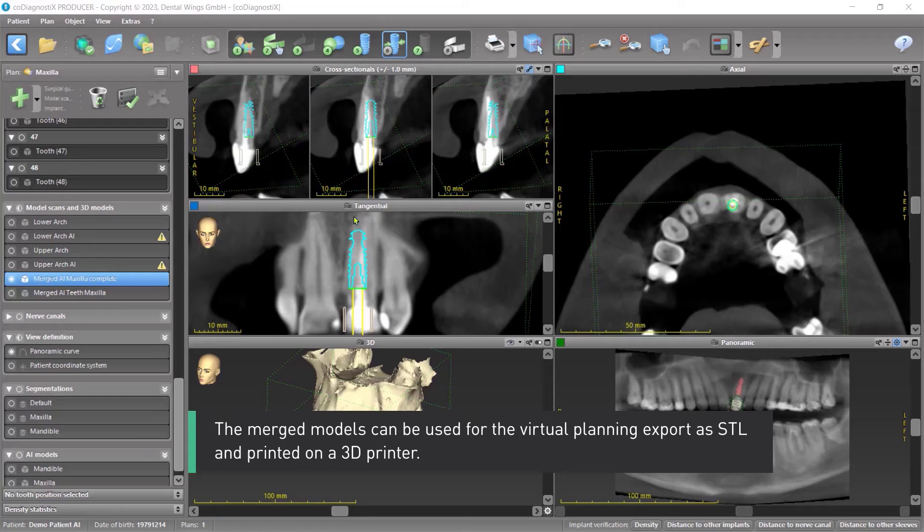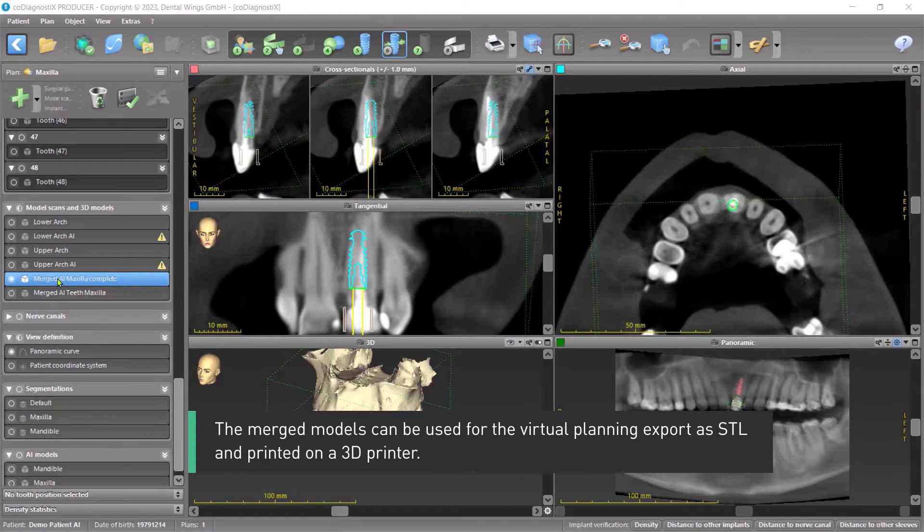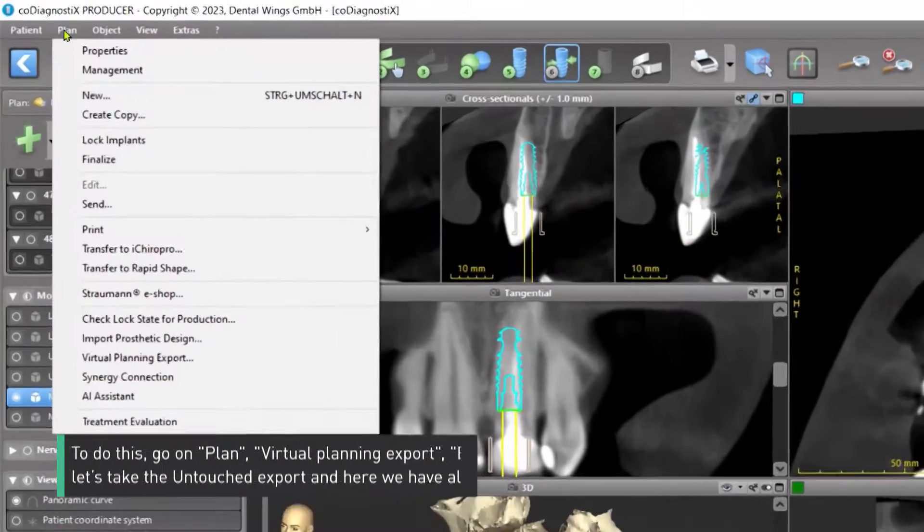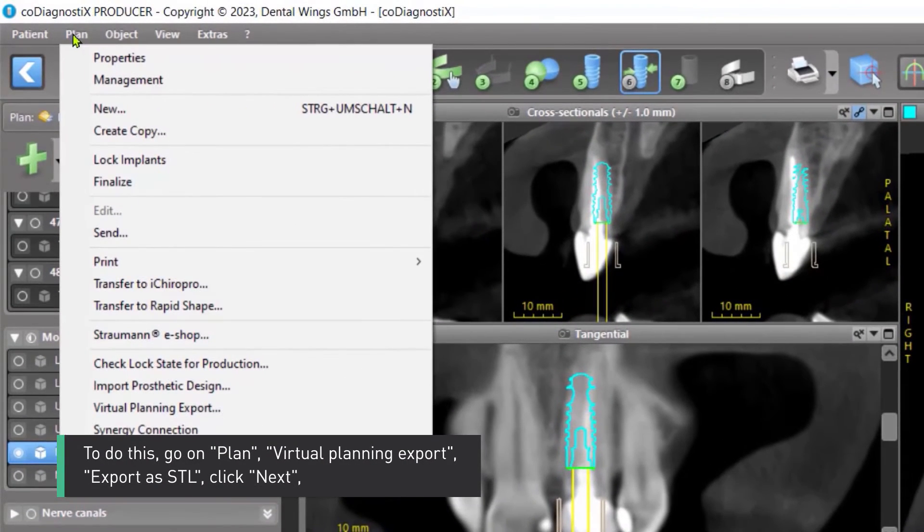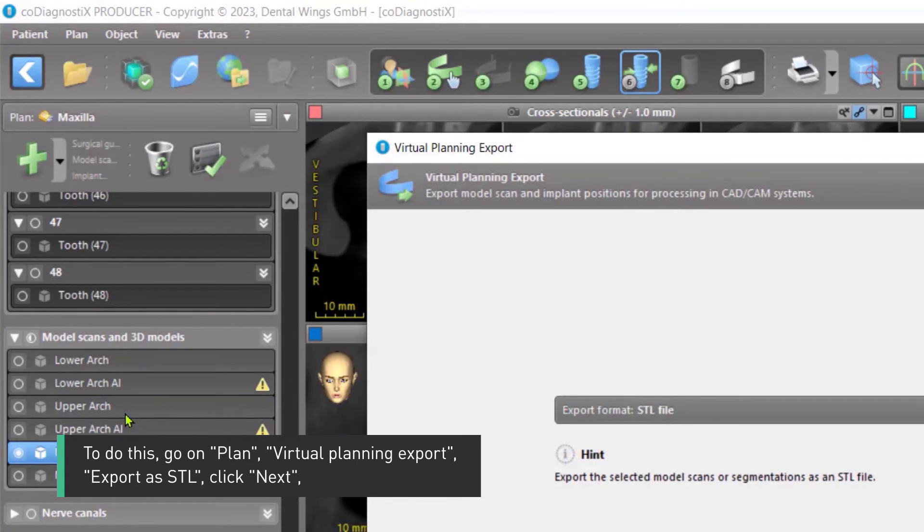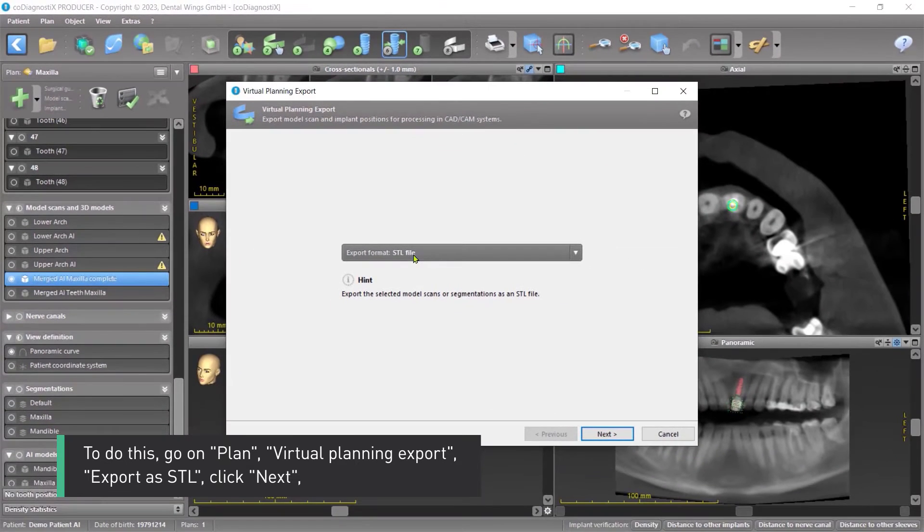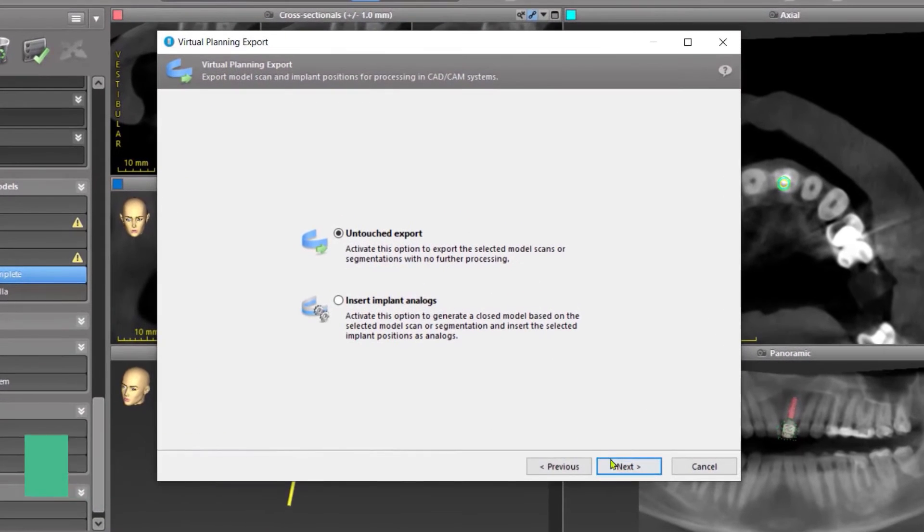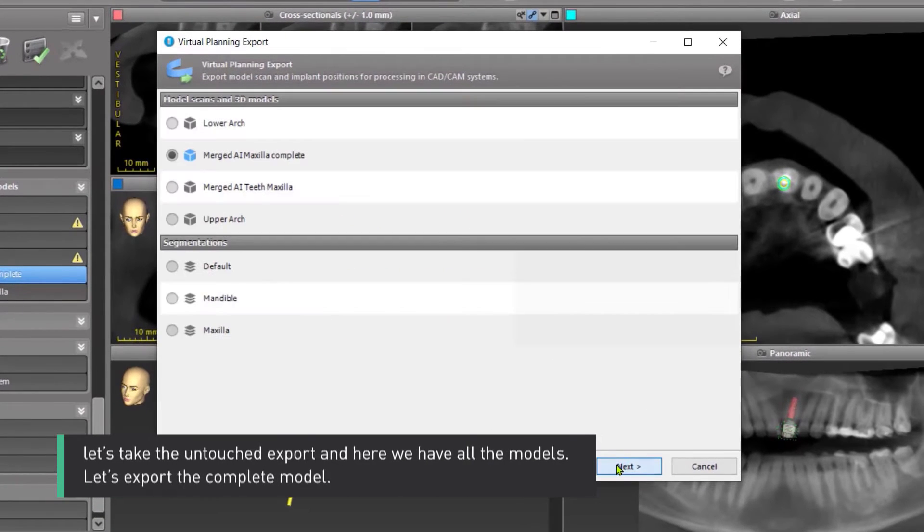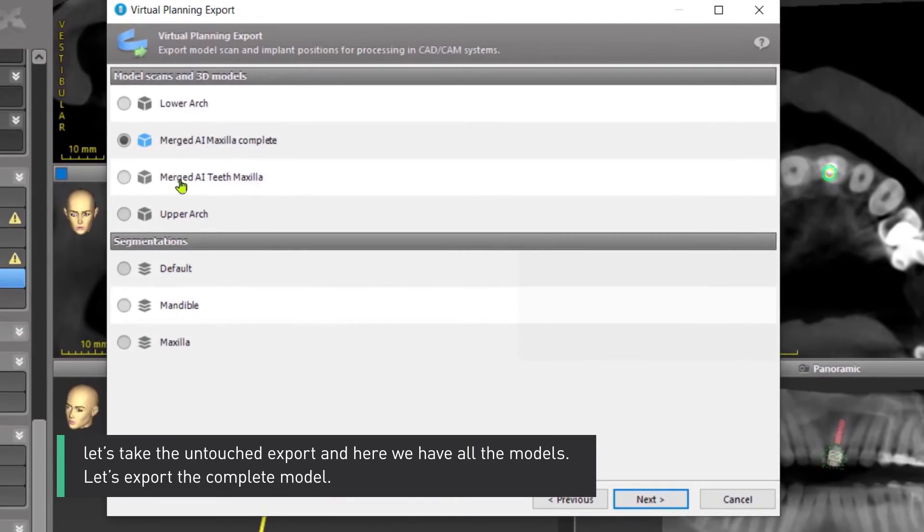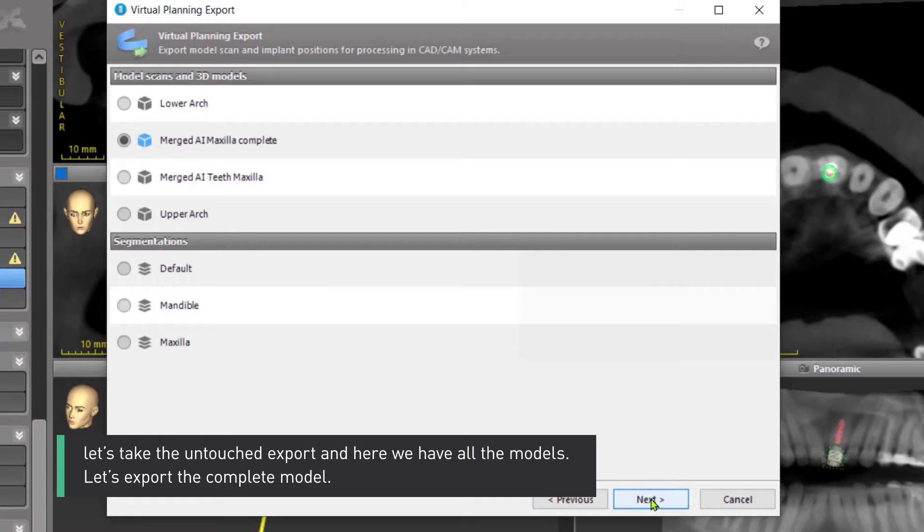The merged models can be used for the virtual planning export as STL and printed on a 3D printer. To do this, go on Plan Virtual Planning Export Export as STL. Click Next. Let's take the untouched export and here we have all the models.